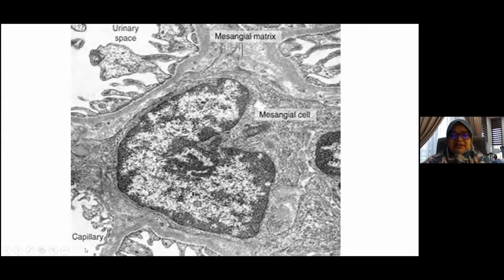Okay, so this loop, which we will see in subsequent slides, is the capillary loop, and here we can start to see the fenestration of the endothelium, which depicts the capillary loop. If we analyze in pathology, we will be looking for depositions, including electron-dense deposits, or any fibrillary structures or suborganizations.